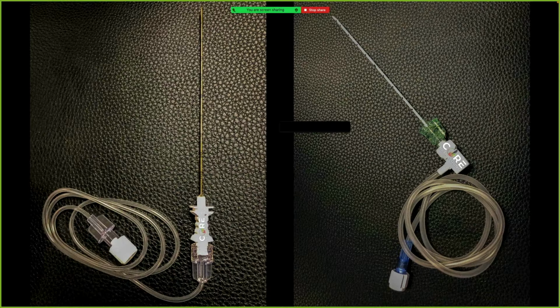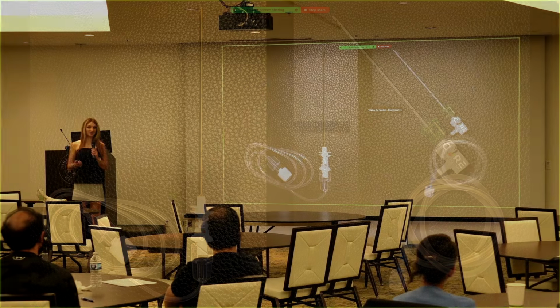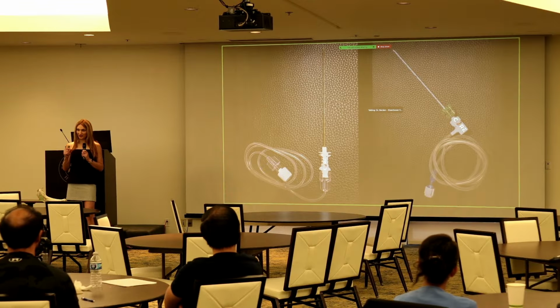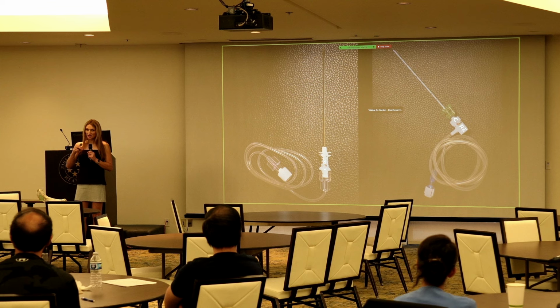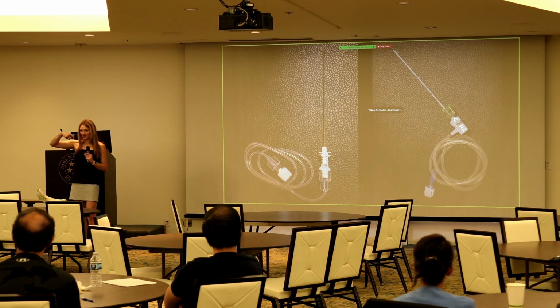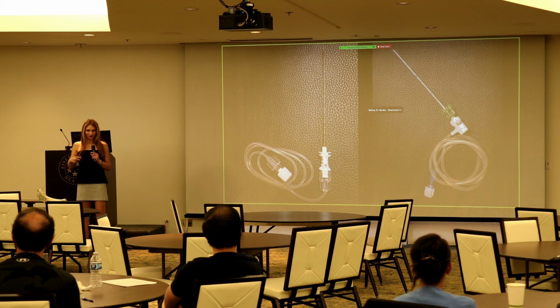Do you guys have nerve block needles? Great, they're amazing. If you happen to not have a nerve block needle, I would use a spinal needle with some IV extension tubing. Because if you can hold the needle, you're so much more dexterous with how you can move things around than if you have that giant syringe a foot away from the patient. You're going to be wobbly, you're not going to be as exact with your pokes.